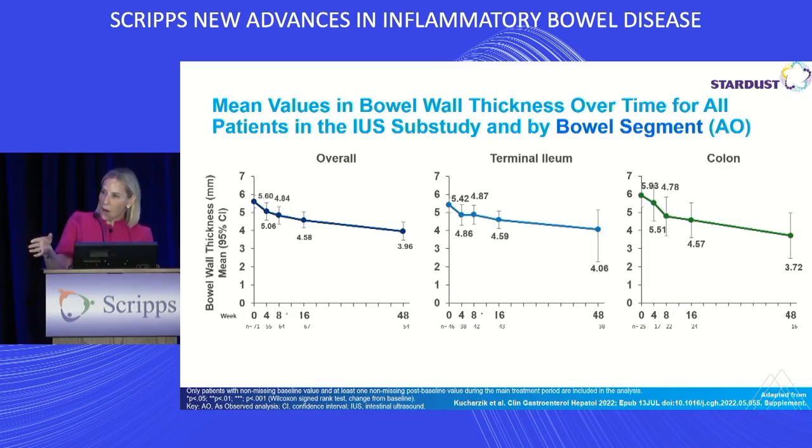We're also starting to look at elastography a little bit. It's not as well established as it is in possibly the MR space, but there is a question about this balance between inflammation and collagen. Are we able to say that this patient would be better served with surgery, similar to what Cynthia was noting around there being elements on diffusion that may help you assume this is more fibrotic than inflammatory? So we're also trying to find ways to counsel patients who aren't meeting endpoints of interest in induction or after one optimization. Maybe we should go to the OR and not be pushing and switching drugs, but we can do that in real time without endoscopy in theory. That's what we're hoping to achieve.